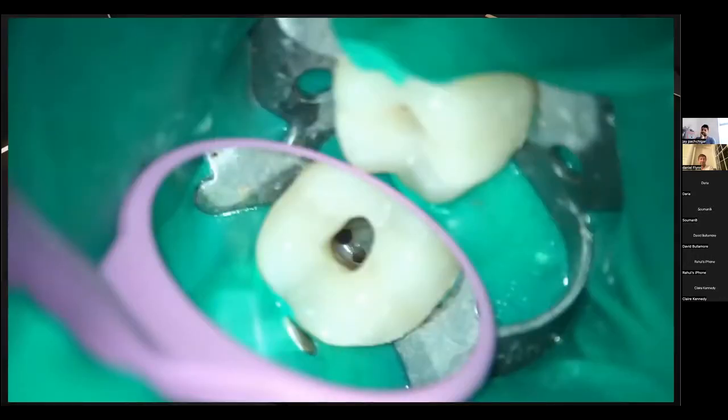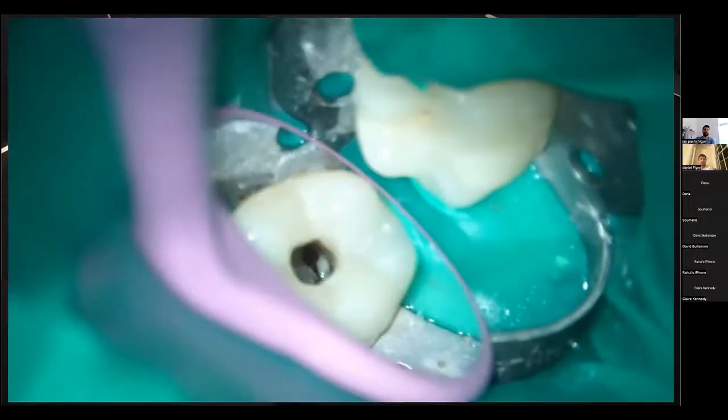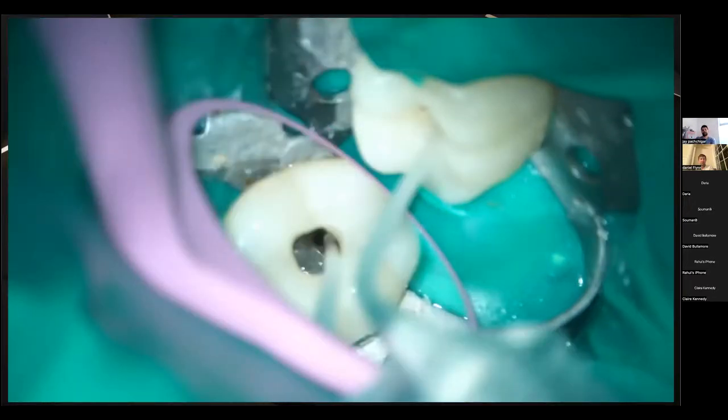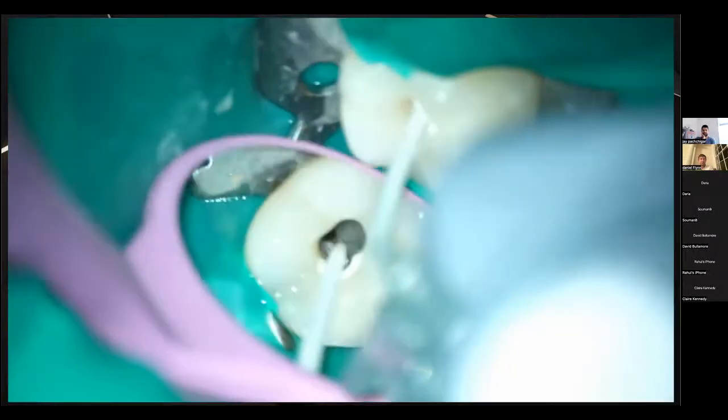So this was one which I'd consider difficult anatomy to fill. It's through, I think, a very new Emax crown, so I was being as conservative as I can. We've got 5 canals here, so you'll see the 3 mesials and the 2 distals over here. On these cases, I definitely will use the plastic tips. They're much easier to get into these areas, and you'll see it just comes through very nicely.